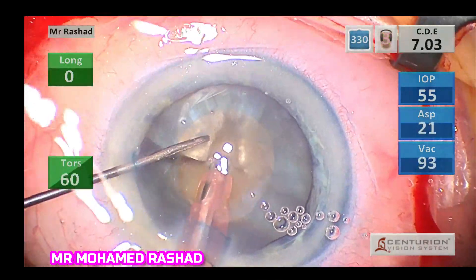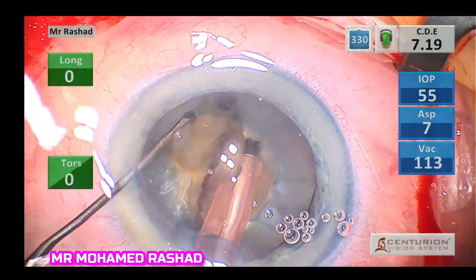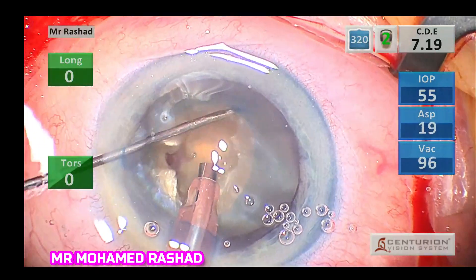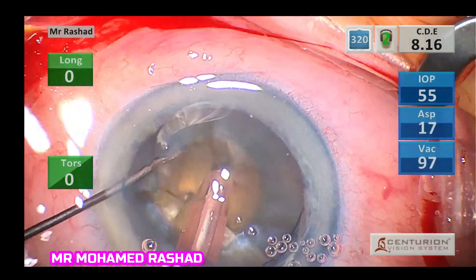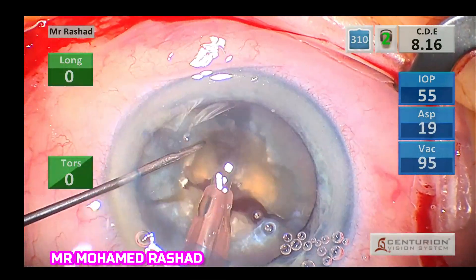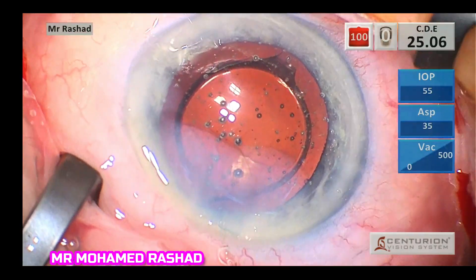For the phaco technique, you can use any technique. In this case I used a divide and conquer technique, which is suitable for this nucleus, as usually the nucleus in this case is not very big.